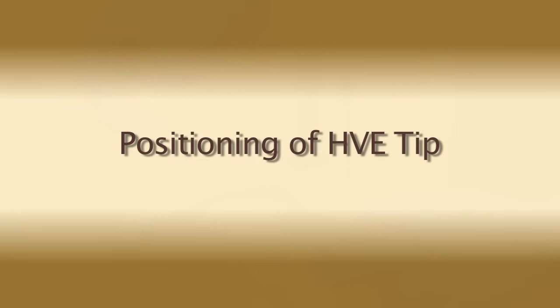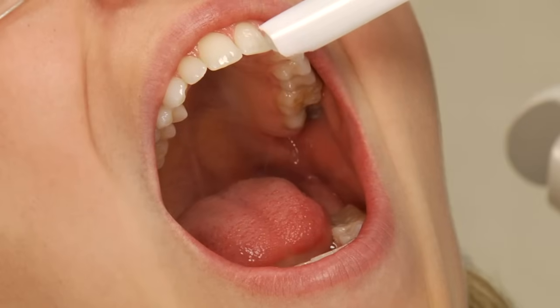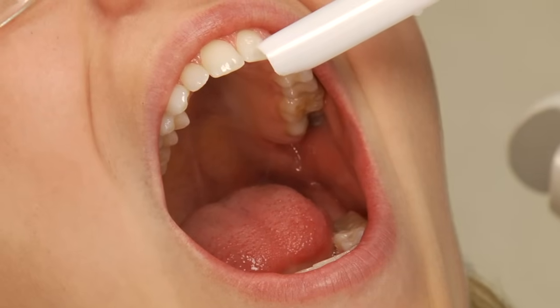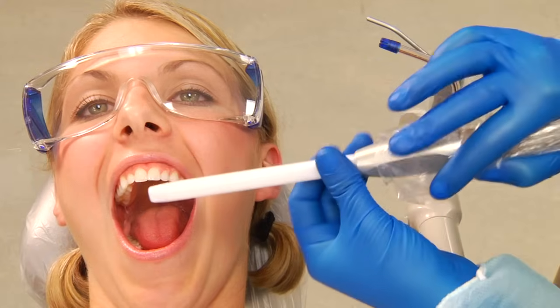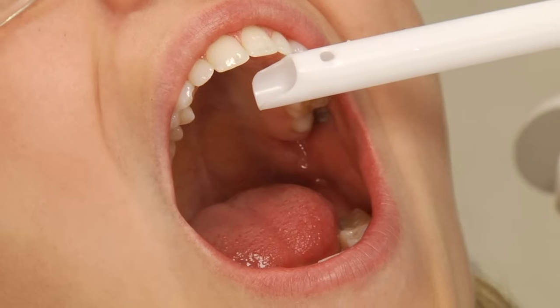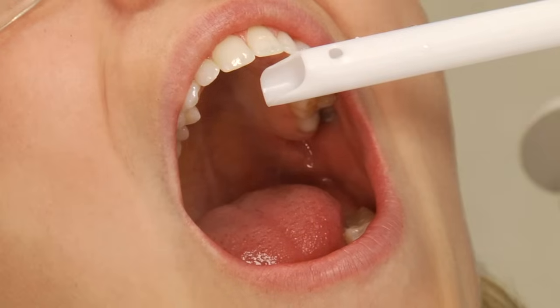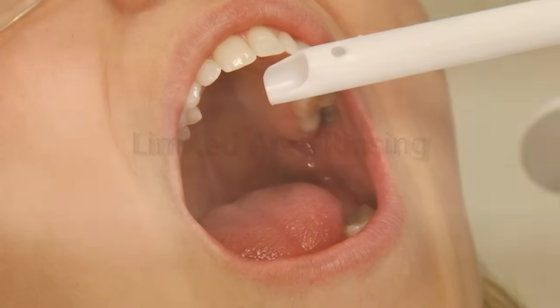When the dentist is preparing the tooth from the lingual aspect of the anterior area, position the HVE tip so that it is parallel to the facial surface and extends slightly beyond the incisal edge. When the dentist is preparing the tooth from the facial aspect of the anterior area, position the HVE tip so that it is parallel to the lingual surface and extends slightly beyond the incisal edge.